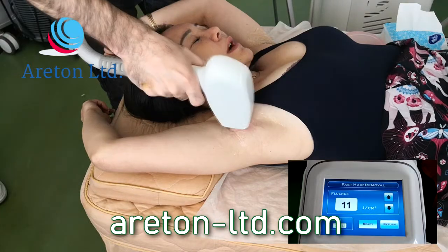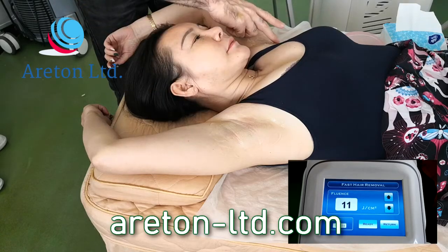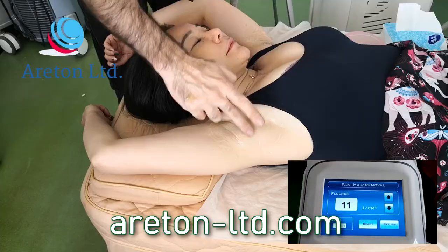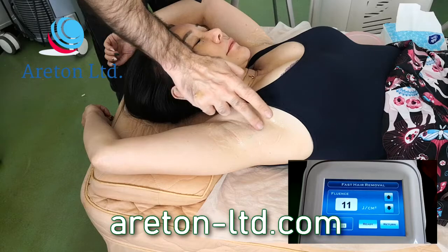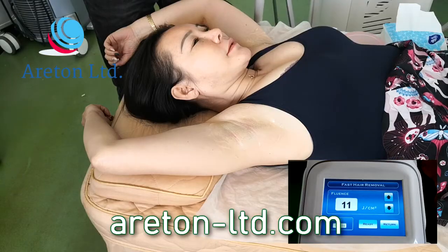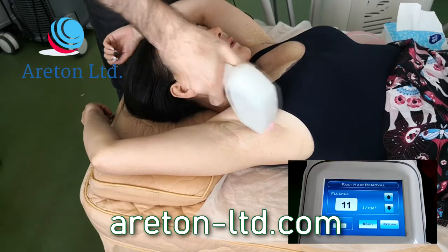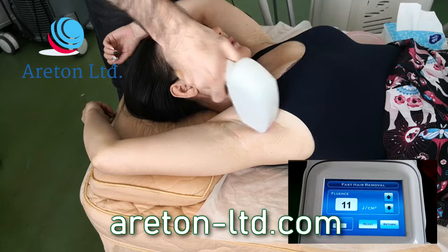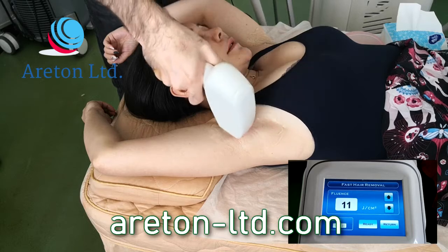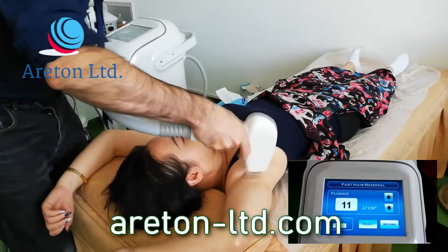So this area is already quite hot. Actually, if I touch here right now, here is very cold, and here is getting quite warm. So what that means is that we're almost done with the treatment. So here is quite warm, and here, the area which we haven't done, is quite cold. So we're going to do it a little bit more, and we're done really. So there's no hard and fast rule as to how long you've got to do it, but if it's becoming a bit hot, then you're almost there. You can get this treatment done within one session, but pretty much within 3 to 4, sometimes 5 sessions is going to be okay.